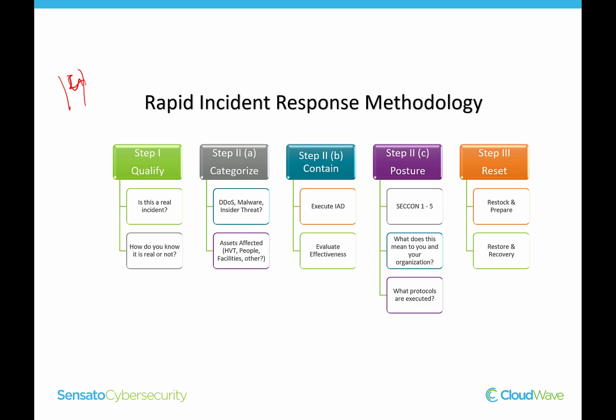What if you have a smaller organization where you don't have clinical engineering on site 24/7? There's an issue with a medical device, and the nursing supervisor says, you know what, let's try to get a hold of clinical engineering. I can't get a hold of them. Let's just call the help desk and see if they can help.